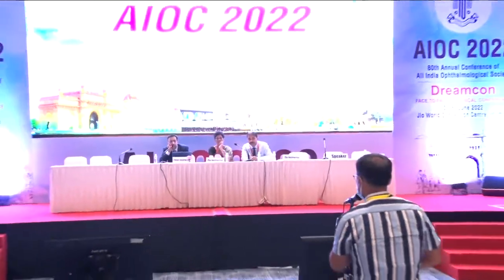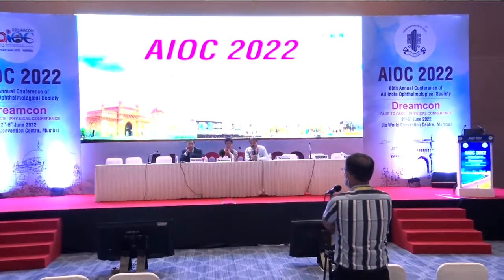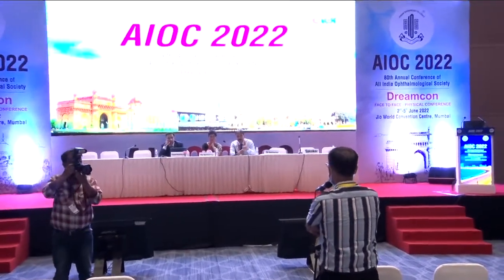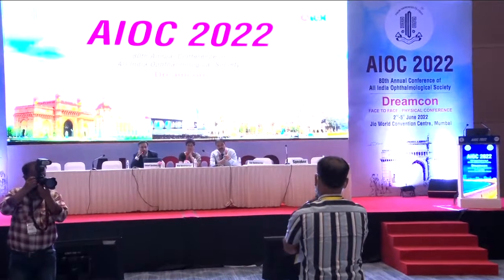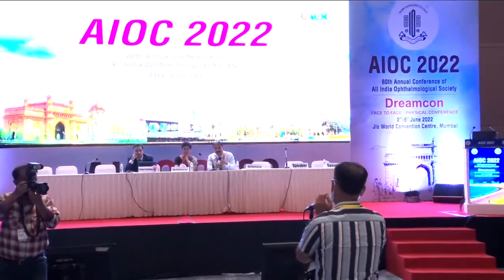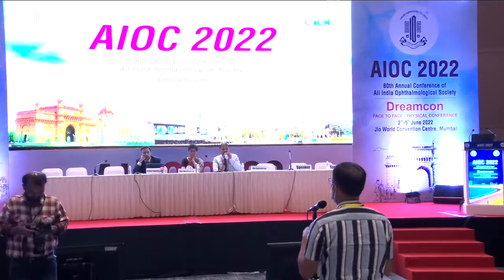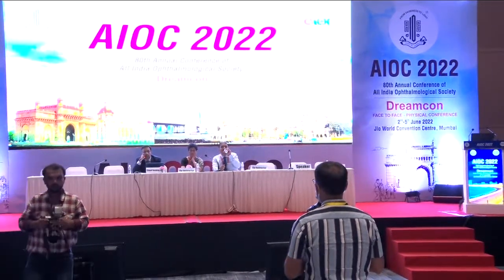Sir, I am doing it in complex PDR cases. What difference I found is that usually I do with the normal illumination, but when I use this chandelier, I feel a little bit low illumination while doing bimanual. So can you help us?